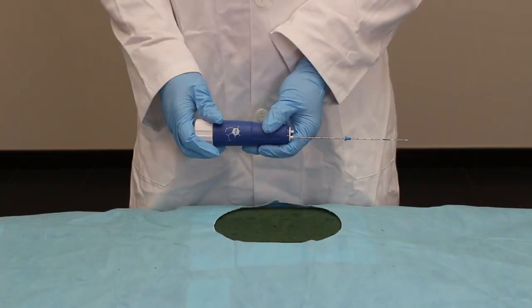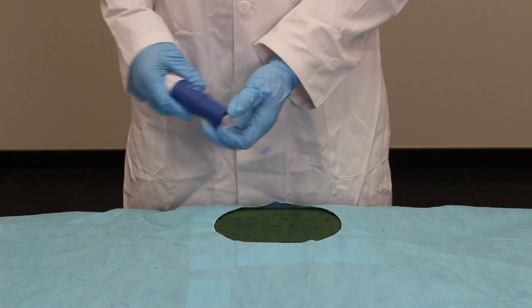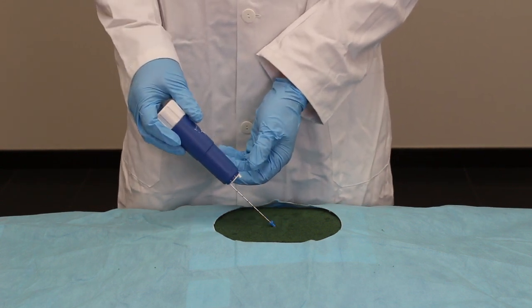If additional biopsies of the same organ are required, withdraw the stylet by rotating the end of the instrument an additional one half turn and repeat the procedure.